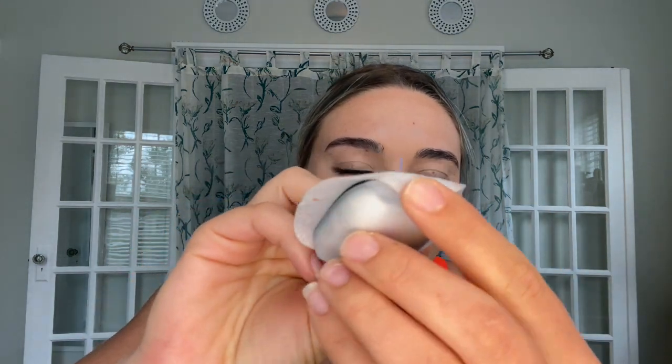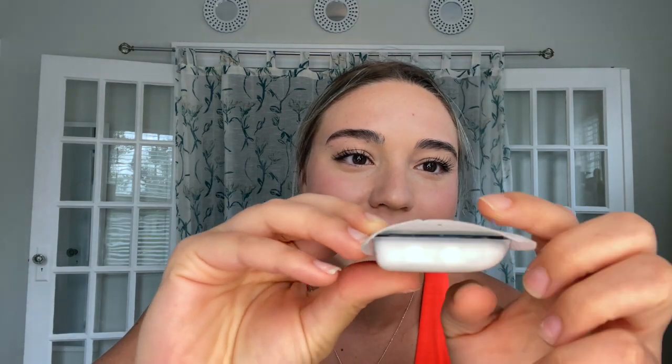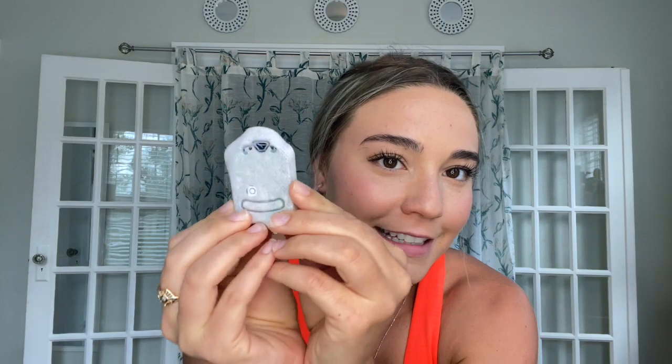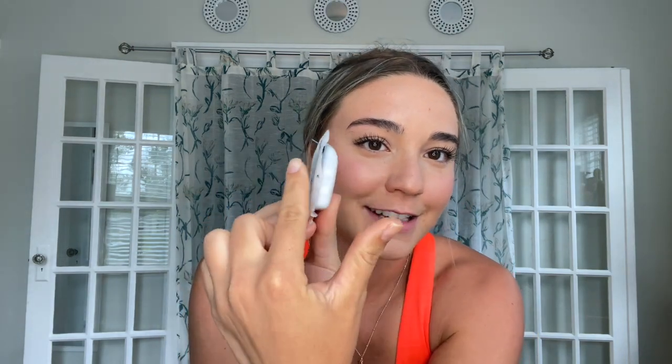Everyone asks how big the needle is — is it actually a needle? So this is what it looks like, and you can see the needle right there. It's a little blue, almost like plastic — I can bend it, I can poke myself with it and it doesn't hurt. That is what goes in my skin and stays in my skin while this is on and gives me insulin.